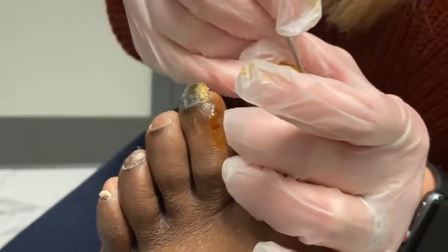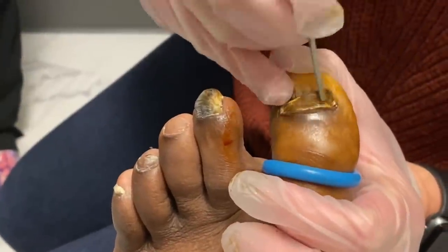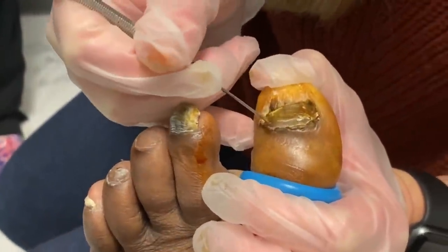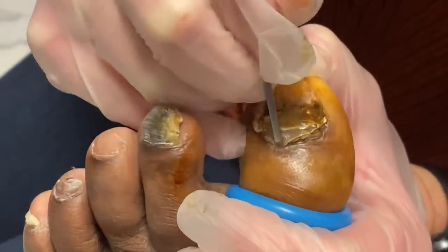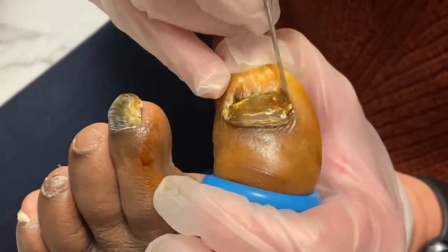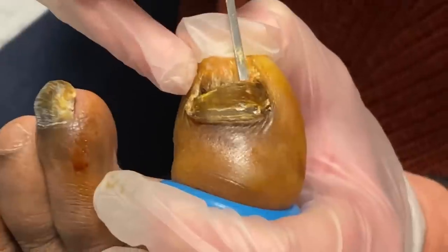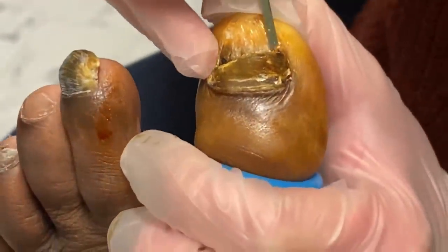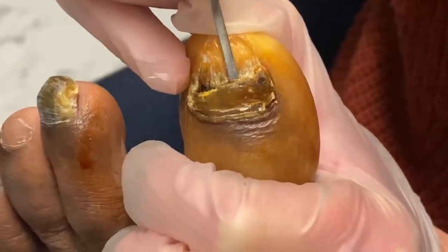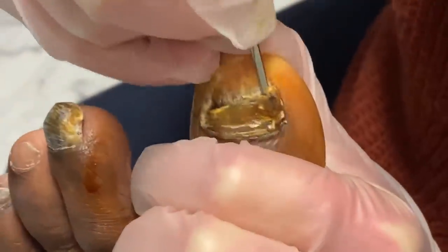I'll test it out a little first. Feel that at all? Okay, good. Just loosen it up. You okay? If that ever happens, you just let them know — we can't make the pressure go away but the pain shouldn't be there. There we go. I'm having to press real hard here to get that loosened up. I don't want any of that left.